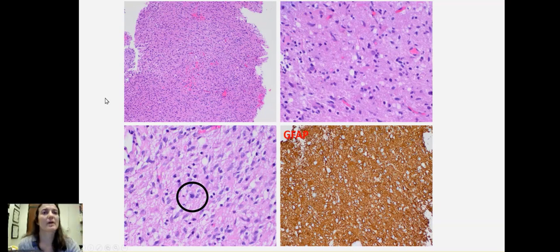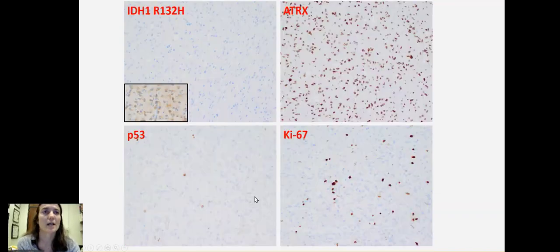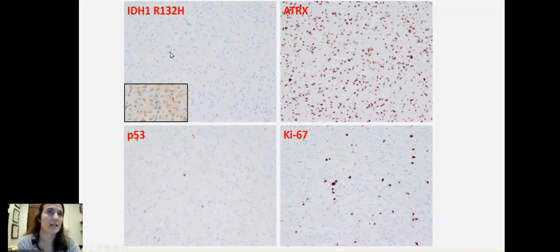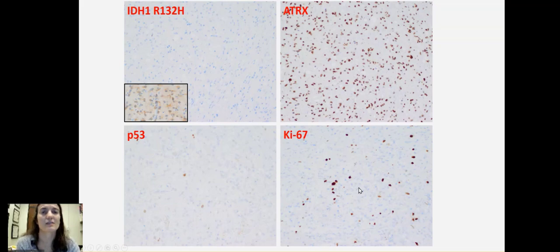The lesion was biopsied and what we can see is a diffusely infiltrative astrocytic lesion. This is a low-power view. Higher power view shows atypical astrocytes that are diffusely infiltrating through the brain tissue, and there are also some mitotic figures. In the workup for this case we did an IDH stain — here's the positive control — and the IDH is negative, so we can assume this is an IDH wild type tumor. ATRX is retained, which is a normal result. P53 has a normal pattern with just a few punctate cells, and the Ki67 is a little bit elevated.